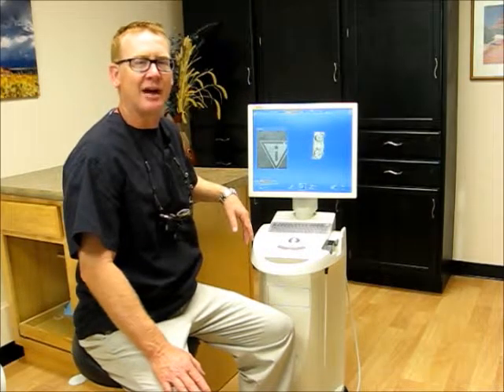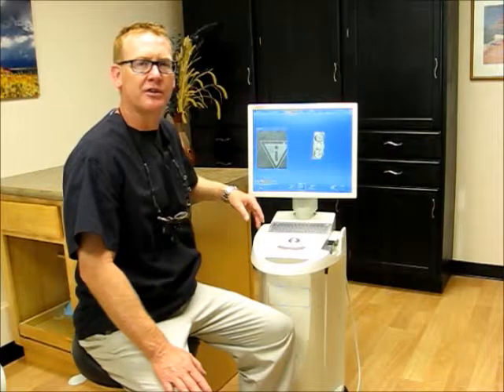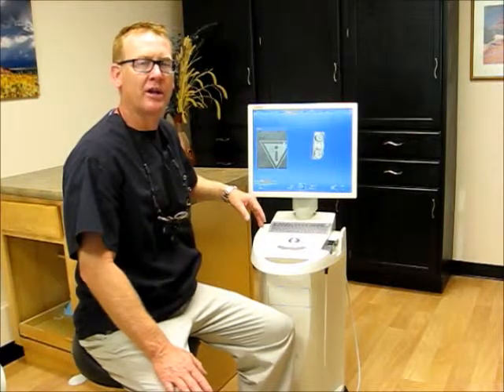Hi, I'm Dr. Francis. I'm excited to share with you the technology we have here at Park East Dental to make crowns — all porcelain, no metal — in just one visit.